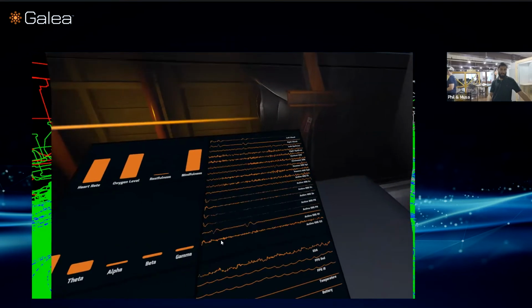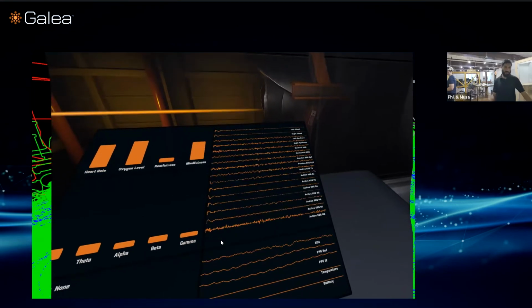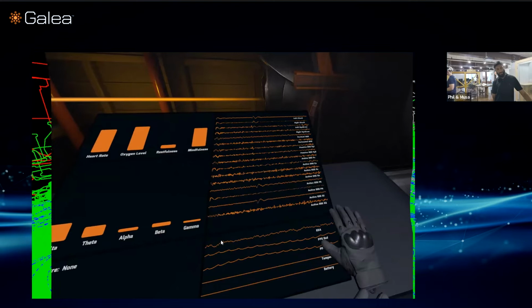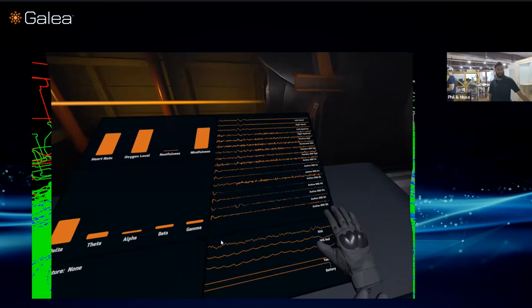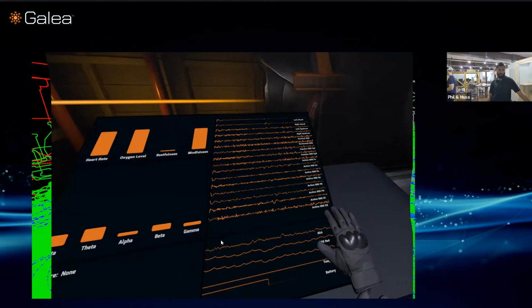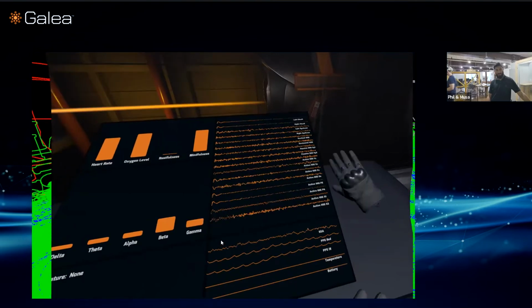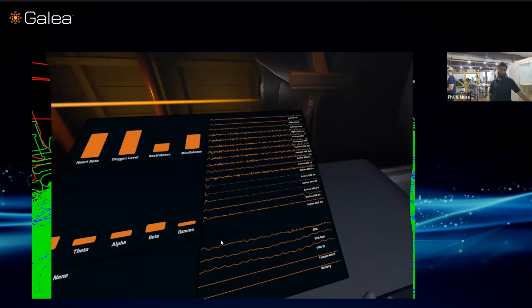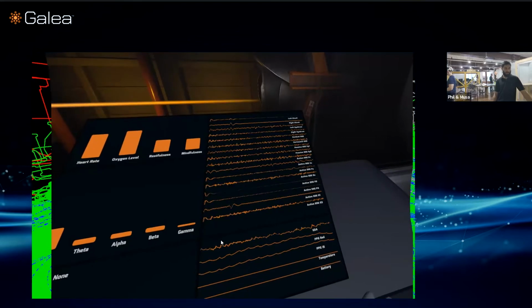So for the hairy regions, which are listed below the passive EEG, we have the active EEG, which is 8 active EEG channels, dispersed along the crown of the scalp all the way back to the occipital lobe, and it covers all the major EEG regions like the temporal lobe, the parietal lobe, and the occipital lobe, all of which govern different mental activities. So, for example, the parietal lobe is used in motor planning and motor execution. The temporal lobe is for memory and decoding audio speech. And of course, the occipital lobe is where your visual cortex is, so it's involved in all the visual processing.